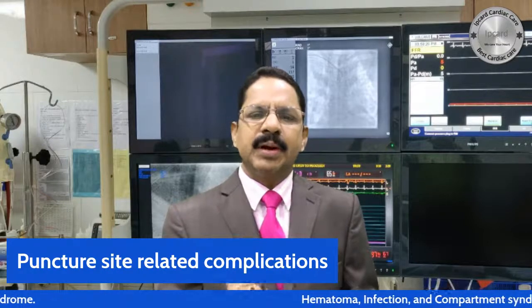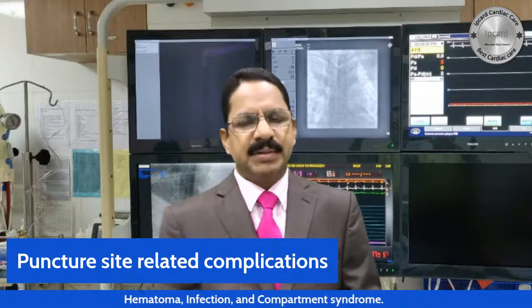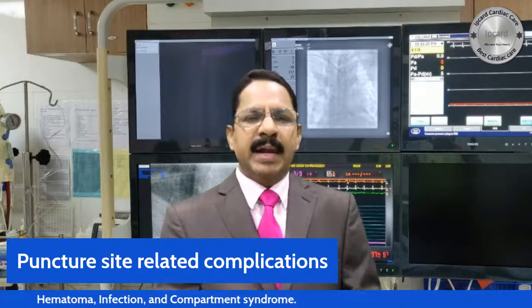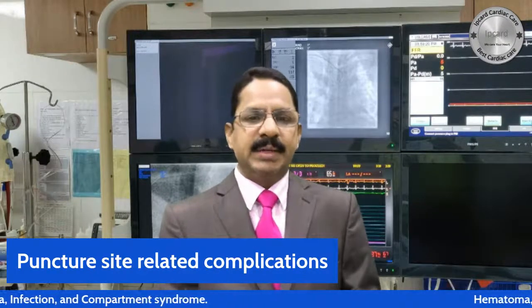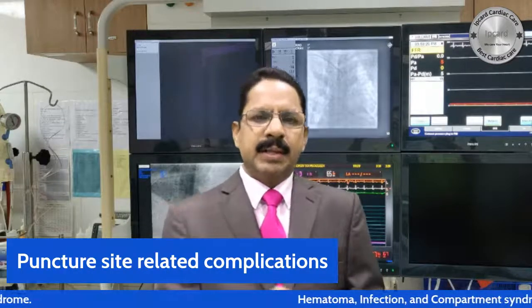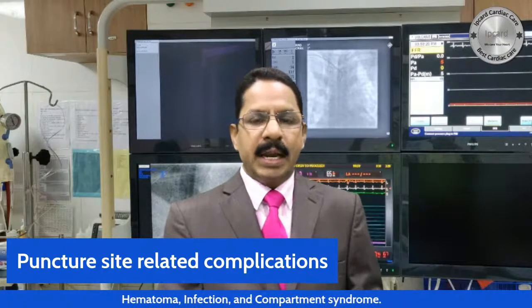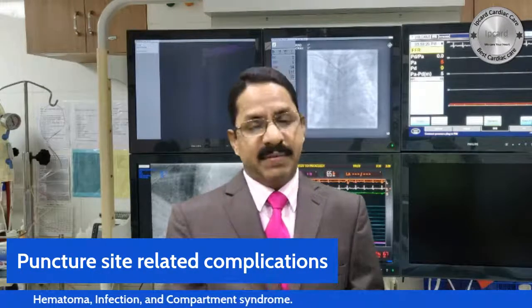In the case of the right or left femoral artery, complications may happen, though no cardiologist will intentionally harm the patient. Sometimes in obese patients, or with abnormal or distorted anatomy, during femoral artery puncture the puncture needle may go into the abdominal wall, or even into the peritoneal cavity.